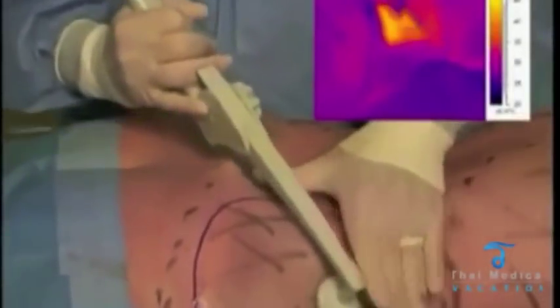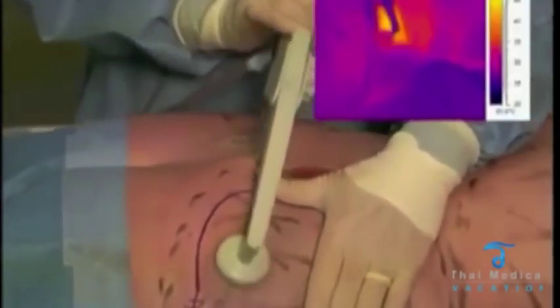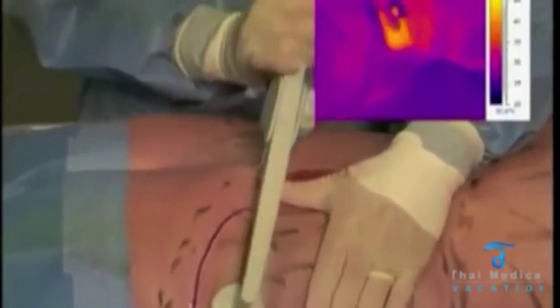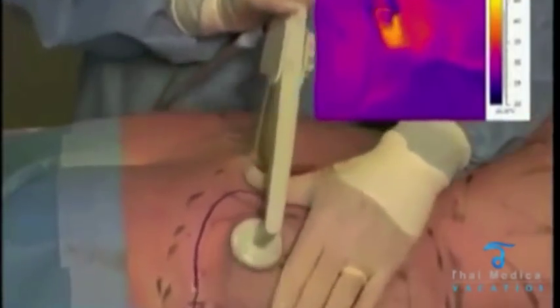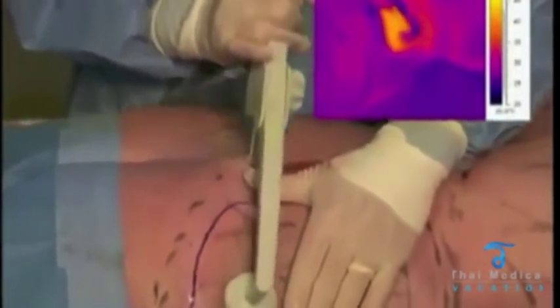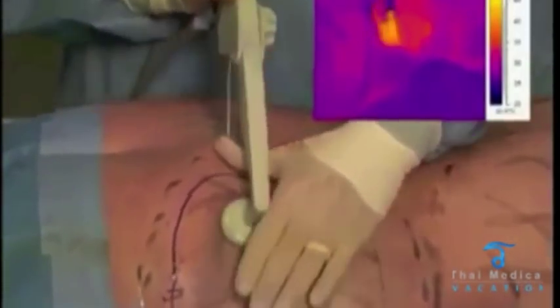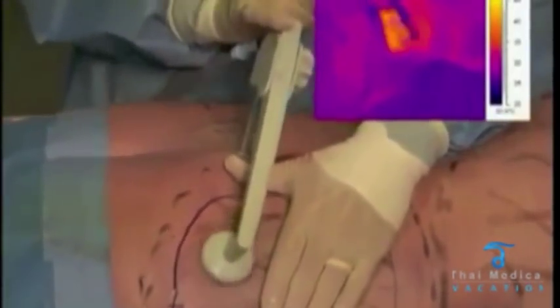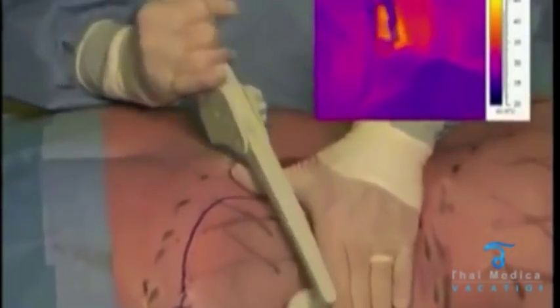I've now got a nice even 38 degrees everywhere, moving around uniformly and maintaining this. Everything between the electrodes is going to be over the critical contraction temperature of 50 degrees — probably around 70 to 80, even 85 degrees near the internal cannula, and around 50 degrees at the subdermal temperature closer to the skin.